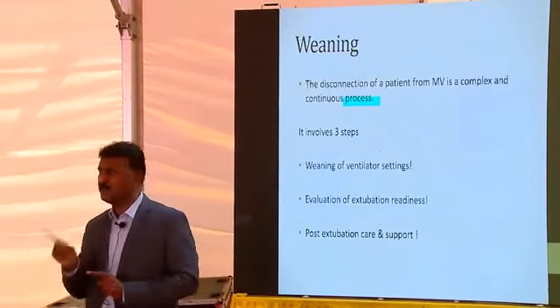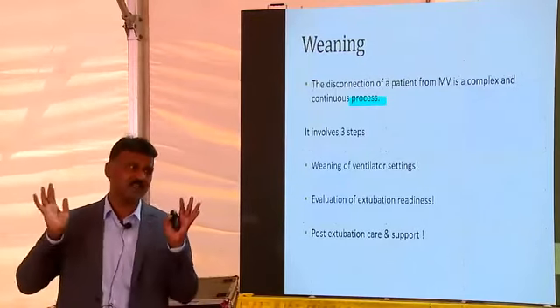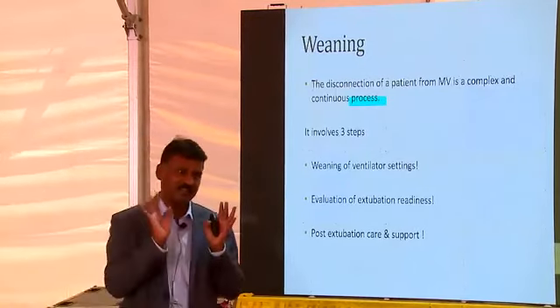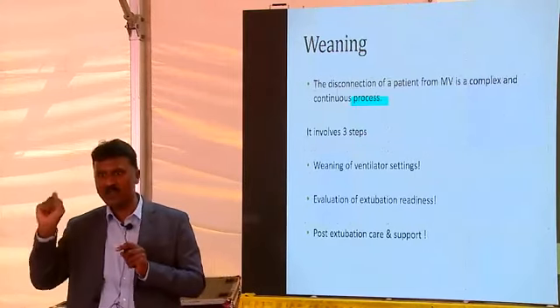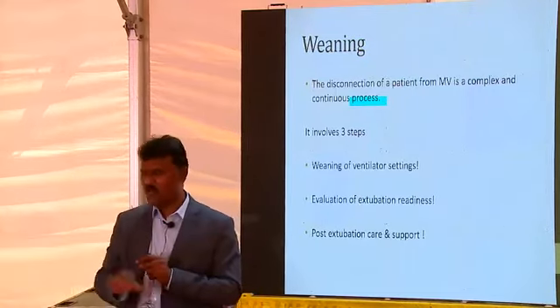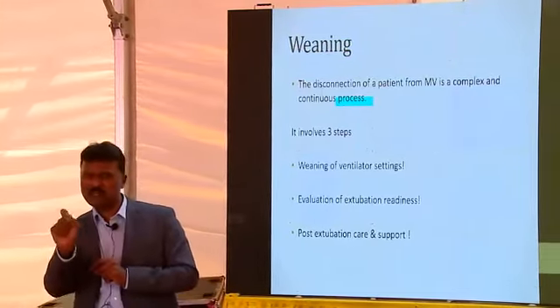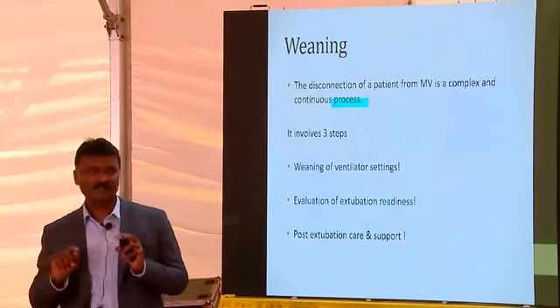nurse says, don't disturb the baby, don't disturb me also. Reduce the pressures, the baby desaturates, he will have a sleepless night. So the PGs leave it, and till next day morning, 7 o'clock, 8 o'clock, the settings will remain the same, and again you come back at 10 o'clock. What happened? We tried to reduce, but we didn't touch.